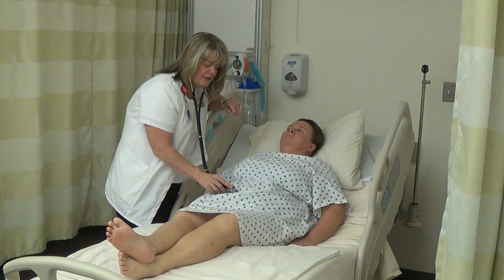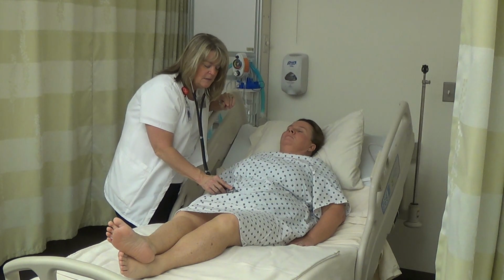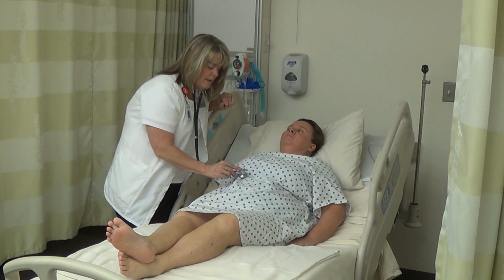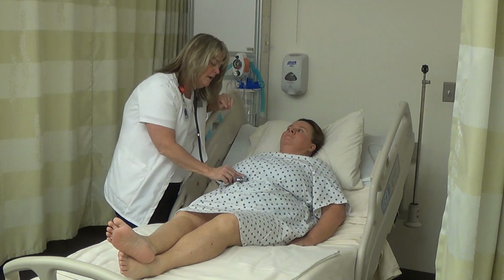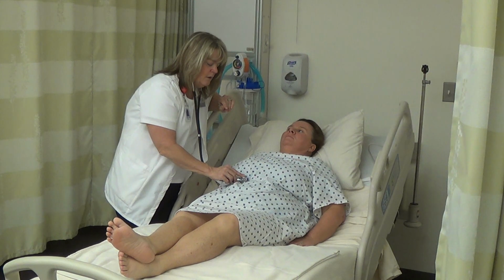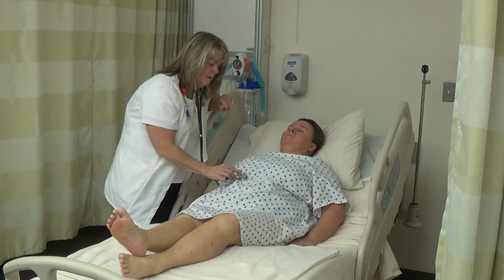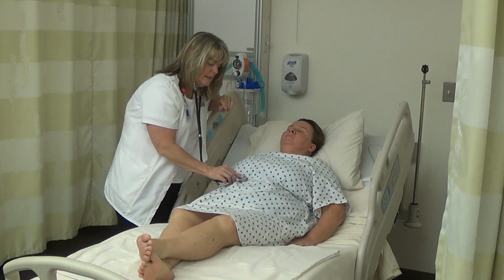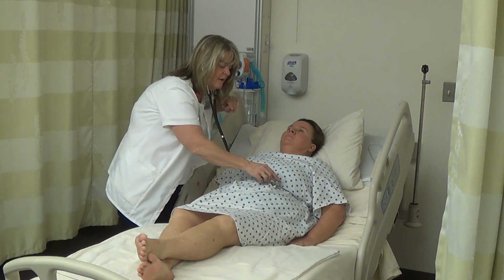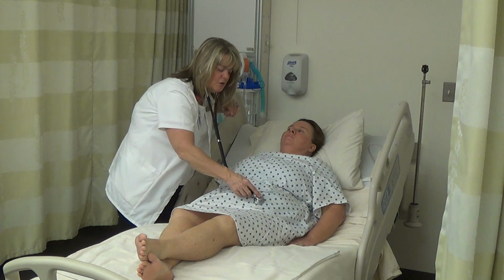You're going to hear 5 to 30 clicks per minute usually for regular bowel sounds. And again, this is where you need to spend some time. If you have a patient who has altered bowel sounds, or maybe they're in for dehydration, or maybe they're constipated, or they're worried about a bowel obstruction, you may hear bowel sounds in one side but not the other. So you really need to listen and compare. You don't have to press very hard. But spend some time to make sure that you're listening.